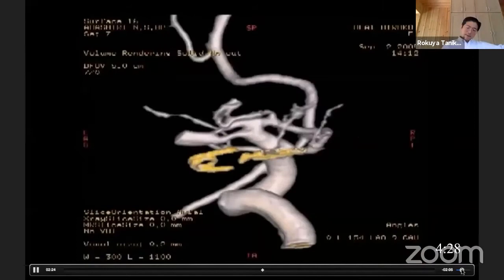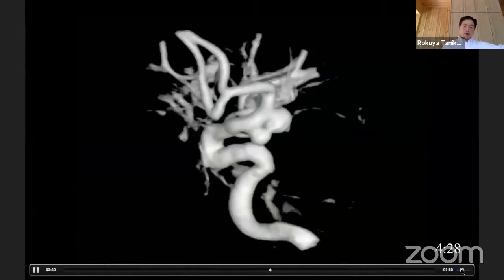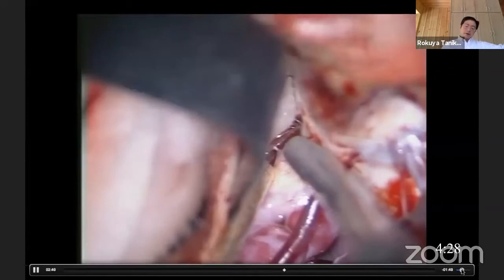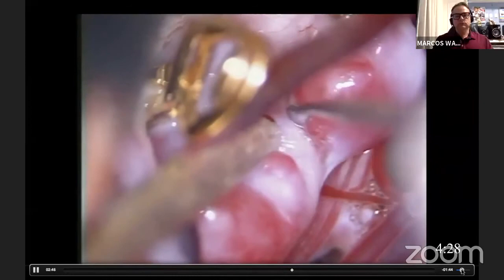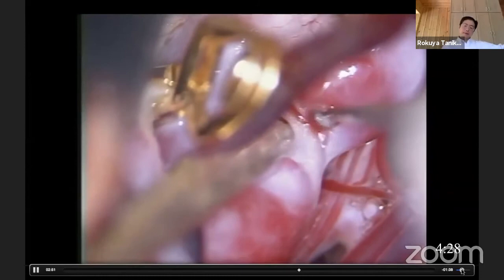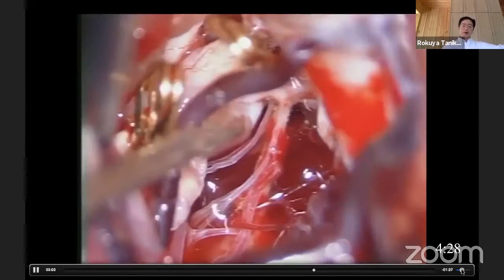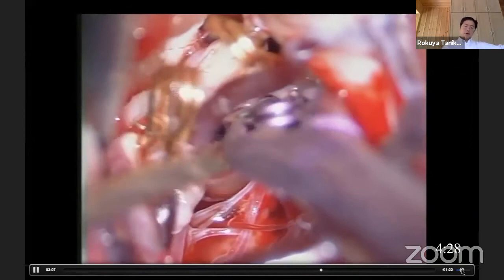CT angiography immediately after surgery confirms the result. This is an example of a kissing aneurysm — this operation was in 2003. Here the PCOM and the choroidal artery aneurysm are strongly adherent. Bleeding happened, but complete temporary trapping of the aneurysm works well. I could completely separate both adherent aneurysms.